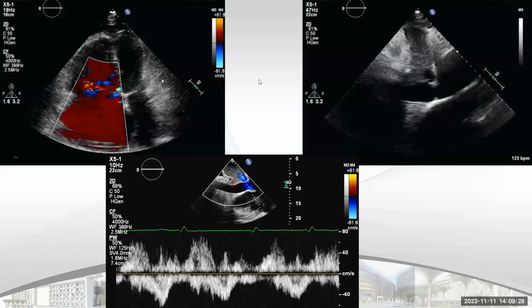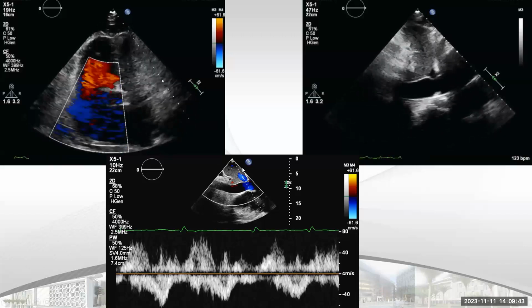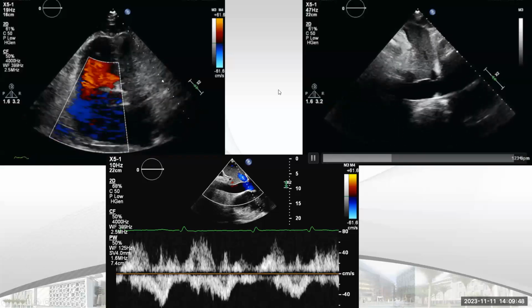Torrential TR, hepatic reversal. Good. What else? Somebody said constrictive pericarditis, severe TR, severe TR. Okay, that's correct. This is severe tricuspid regurgitation. Why did you say severe? Because of dilated IVC, but still dilated IVC could be because of pulmonary hypertension.